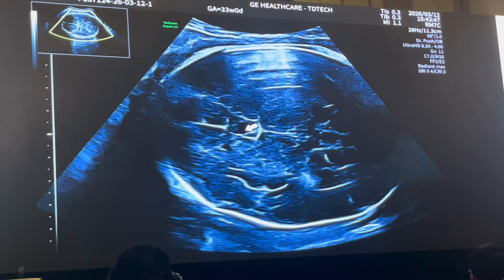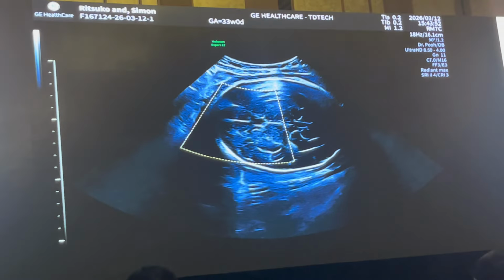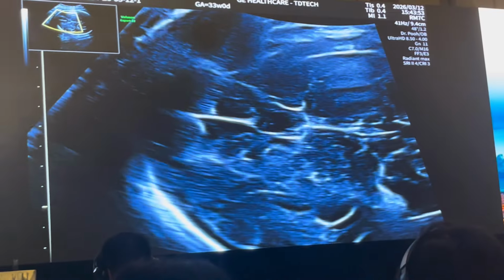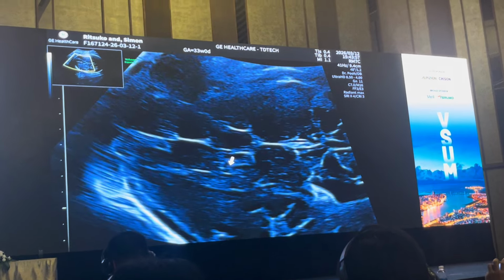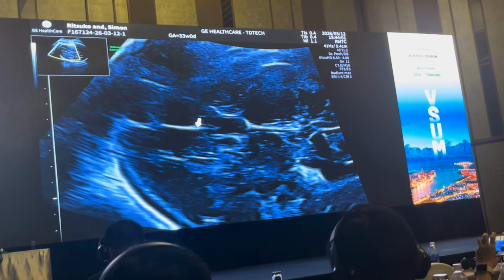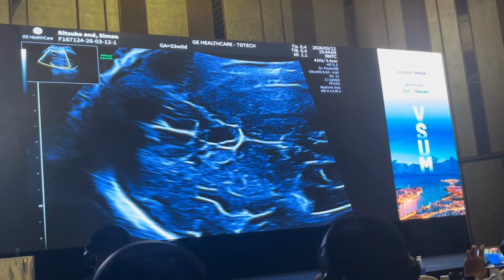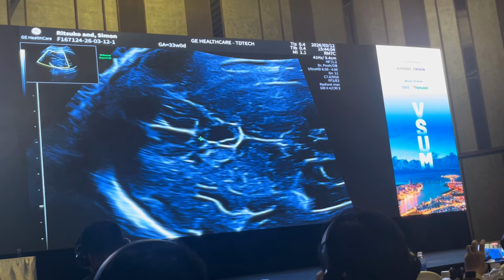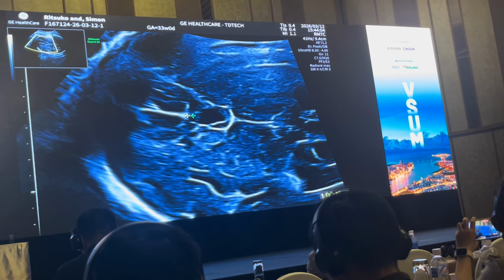And if we magnify with HD zoom, just like anything we're imaging in obstetrics, make sure your magnification is adequate. We have the point where the anterior horns converge to the leaves of the cavum septum. So these are the leaves of the cavum septum. It's not very well seen, but that is the genu just at this point here. It's hypoechoic. Remember I said it's got echogenic borders and hypoechoic in the center. I call it the sandwich.